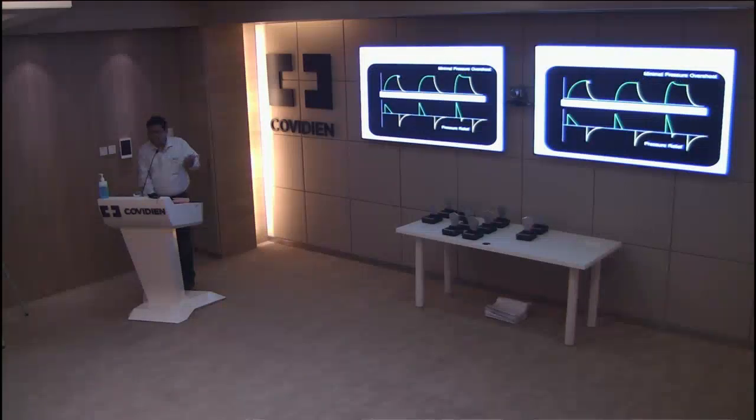It means the patient is likely to be flow starved. The patient is likely to get air hunger. This is too slow. This is too fast. What should be ideal should be something like this. This is how the rise time should be set, so that the graph looks something like the pressure tracing. You understand? This is how you adjust rise time. It's a matter of patient comfort. It doesn't make a big difference.